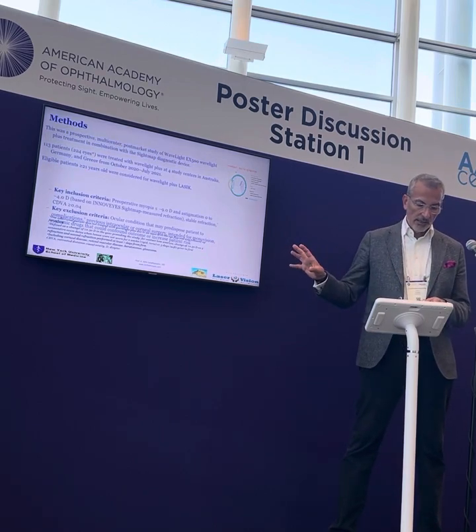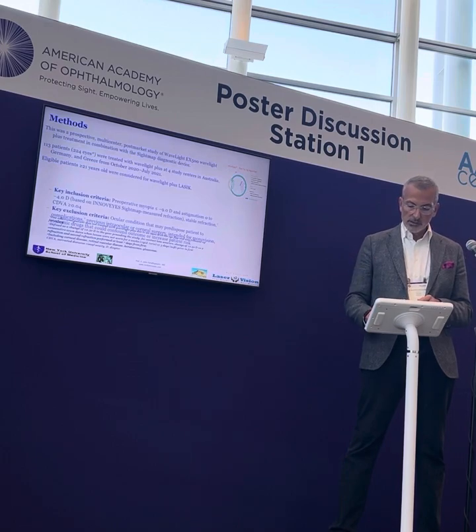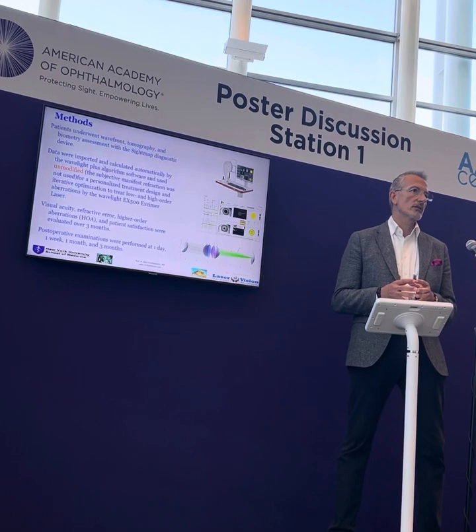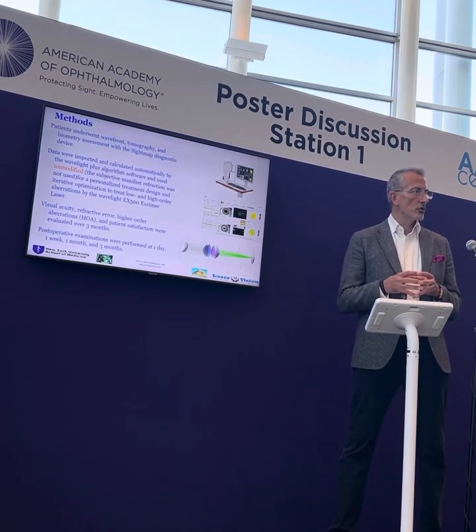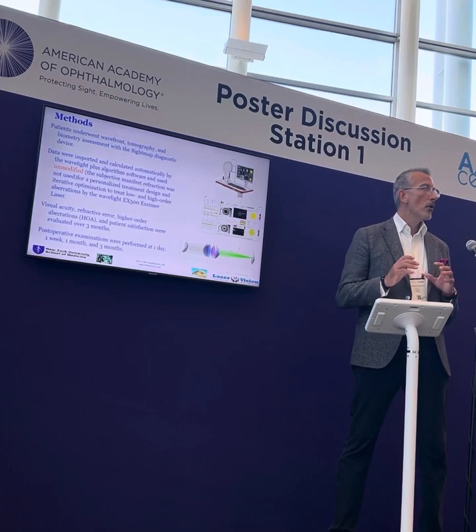So these are the key criteria: under 9 diopters of myopia, up to 4 diopters of astigmatism, the standard exclusion criteria for pre-existing corneal disease, pregnancy test for the female patients, and in the methodology, the key thing was that the data provided by this technology, and this is an automated algorithm, were used by all surgeons, and I'll pause for a few seconds, unmodified.